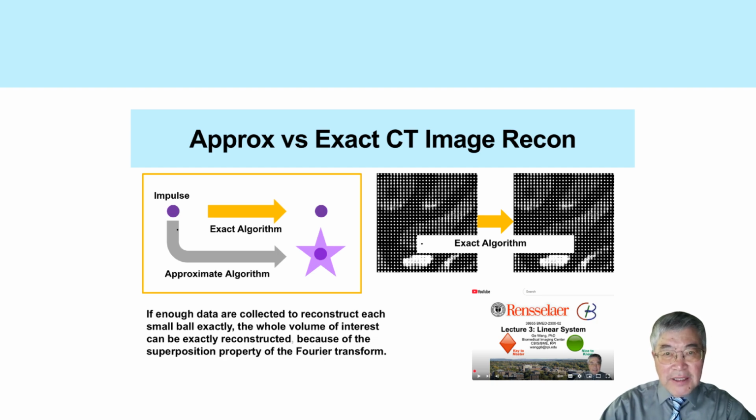There are special cases where error cancellation can happen. For example, a longitudinally homogeneous long object may be reconstructed very well by a generalized Feldkamp type method. But in the general case, approximate corrections lead to approximate reconstruction. This comparison helps us understand the difference between approximate and exact cone beam CT algorithms.